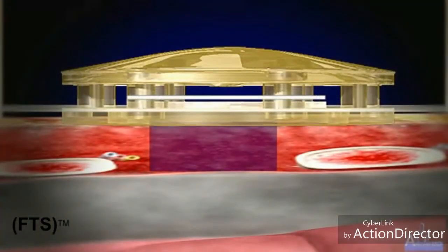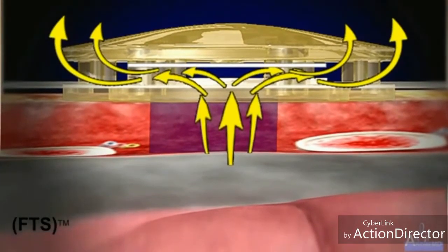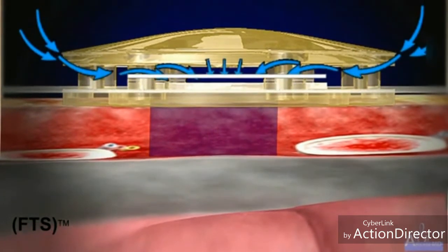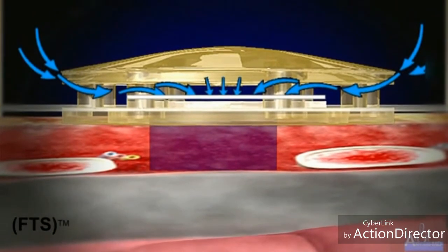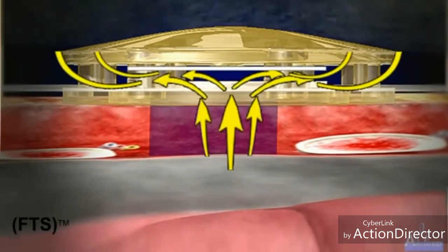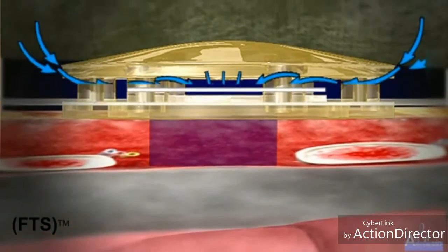The one-way valve flap opens for air to escape and closes to block inward flow. The valve's hardened outer top with side ventilation prevents occlusion of airflow by any external cover.